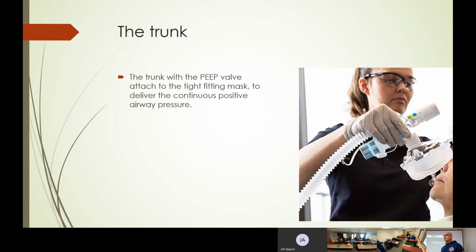Yeah, just wear your PPE. And I'm hoping not to contradict anything that's being said out there or downplay anything, but I really hate the thought of us not properly treating a patient because they might have this disease, or distancing ourselves so much from a patient that needs our help that we can't help them because we're afraid of what might be going on when we should treat what is going on. Okay, so that's just my 2 cents on that. But yeah, wear your proper PPE. This has a valve in place to try to help and protect us.